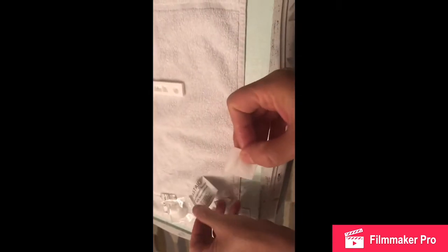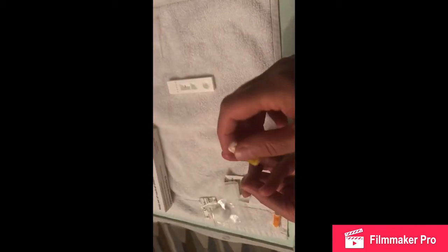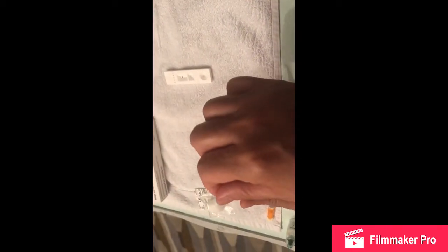We've got the cleaner here to wipe the finger before we start, so we make sure that it's all clean and hygienic. Just a quick wipe like that will do. We will now open the yellow needle, which will prick the finger.